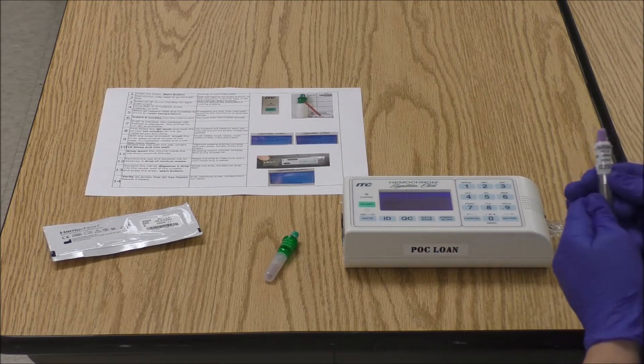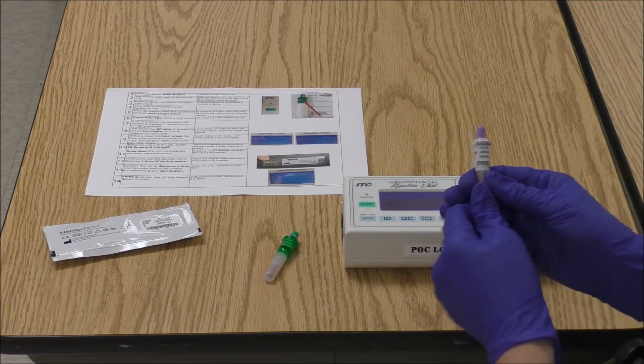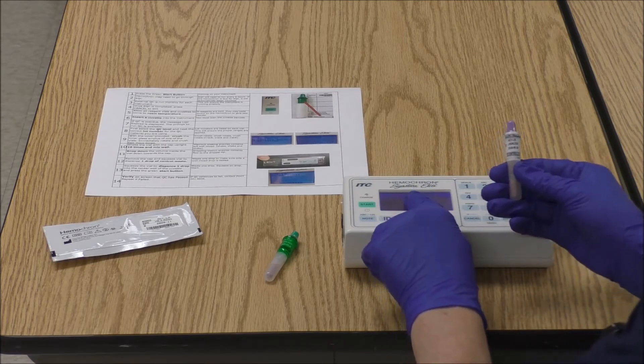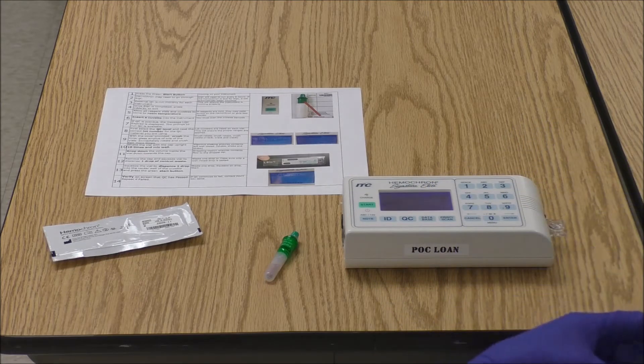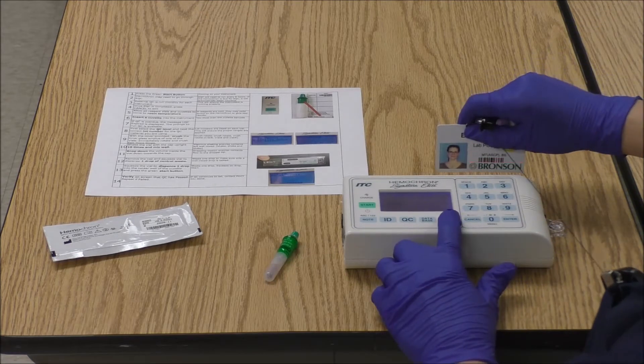Now I need to select the lot number of the control that I'll be using. The lot number on the vial right here needs to match the lot number that is showing on the screen. Once you verify that it matches, go ahead and select the number that corresponds with that. Enter OID means enter your operator ID — you do that by scanning your badge.